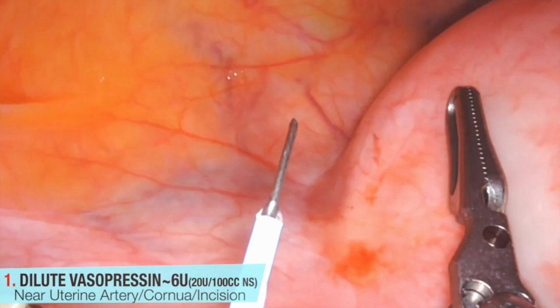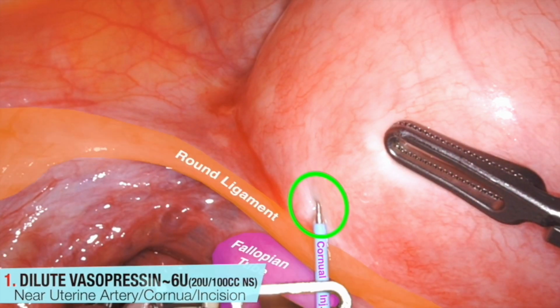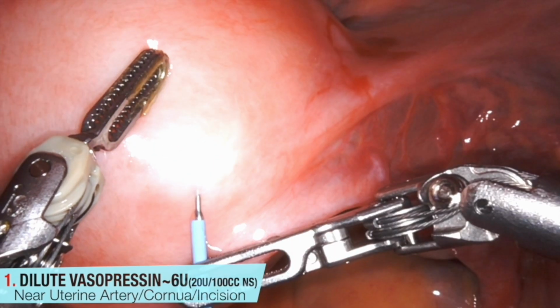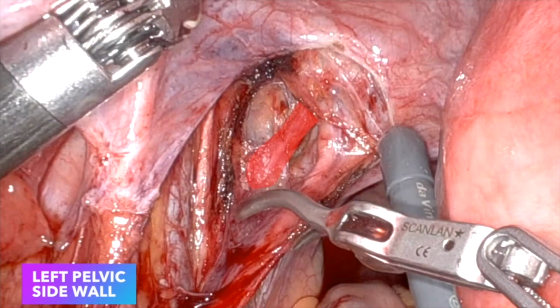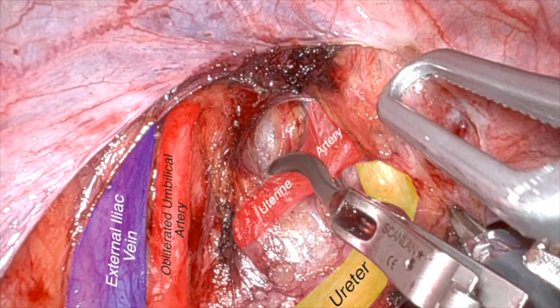This intraoperative footage demonstrates the use of a Williams cystoscopic needle to inject dilute vasopressin around the uterine blood supply and along the incision site. Another method to help minimize blood loss is the temporary ligation of the uterine arteries and utero-ovarian ligaments, as shown in the surgical footage.